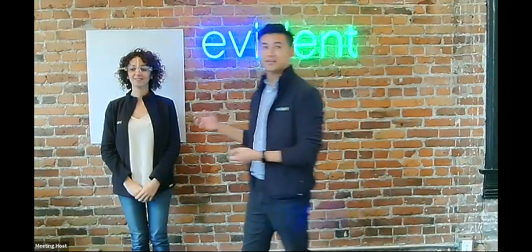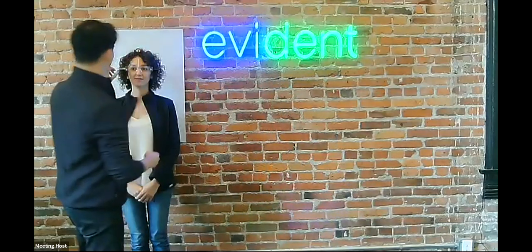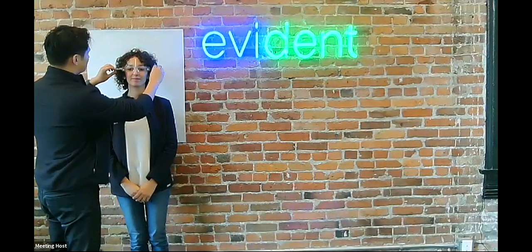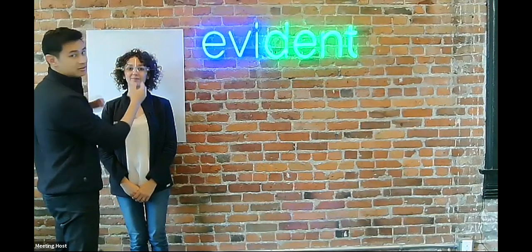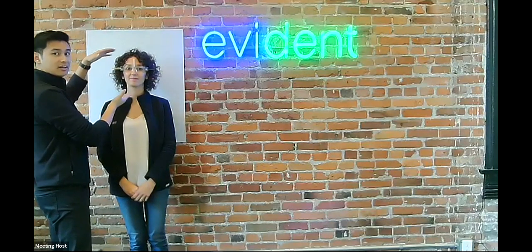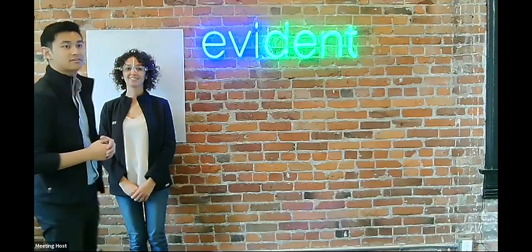Once she's put them on, as a dentist, you're going to be helping her realign them and make sure they're balanced. As I was saying before, there are two level indicators here. So realign them and just make sure that the bubble on both of them is in the middle. You can tilt their head a little bit if you need to, but as long as they're both level, that's great.